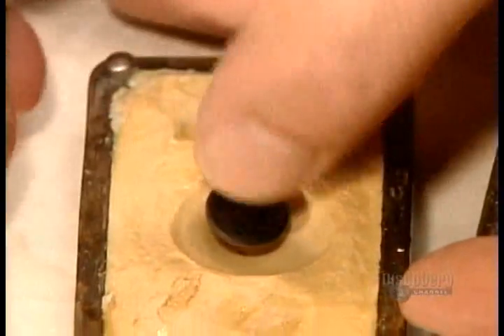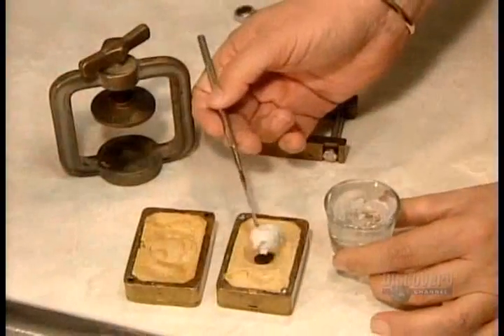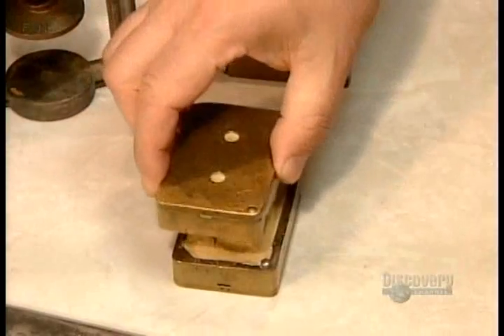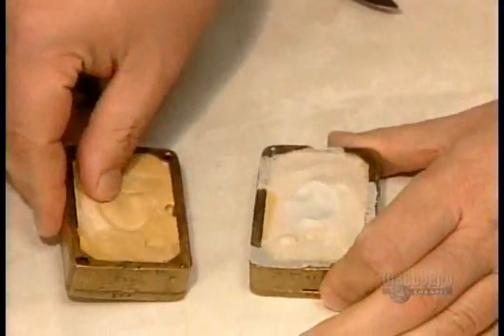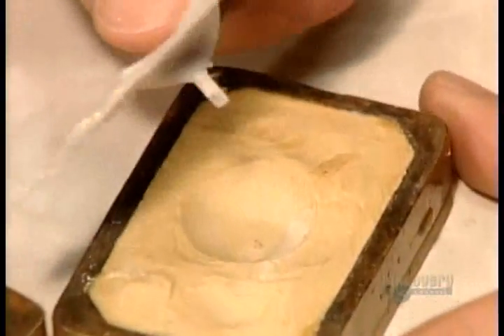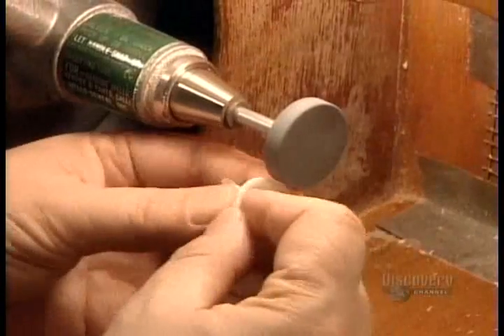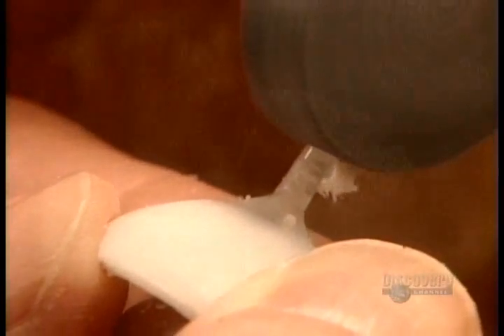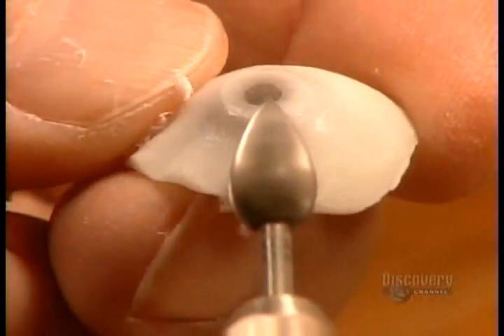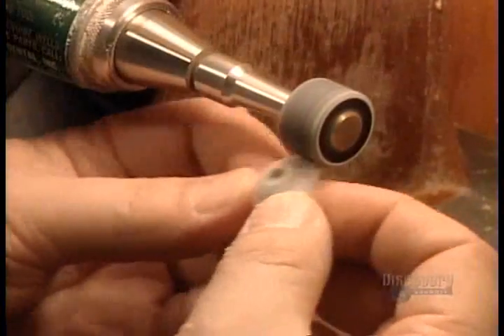The iris then goes into the plaster mould, covered with white acrylic dough. After the same high-pressure curing process as before, out comes the artificial eye, covered with excess white acrylic. They trim off that excess and the peg using a grinding tool and a cutter. This refines the shape and exposes the iris buried underneath.